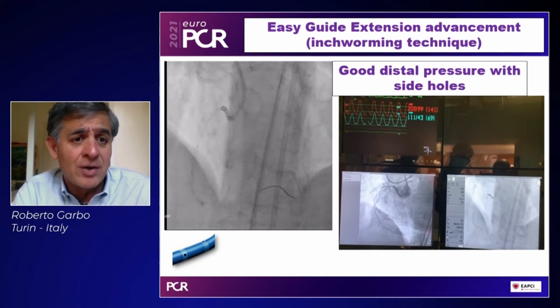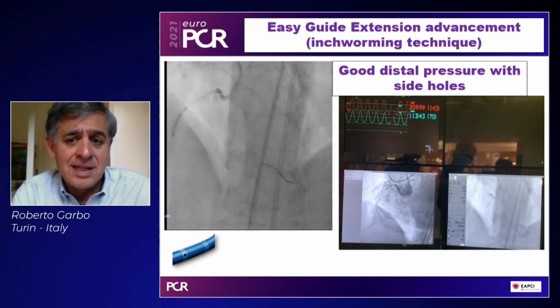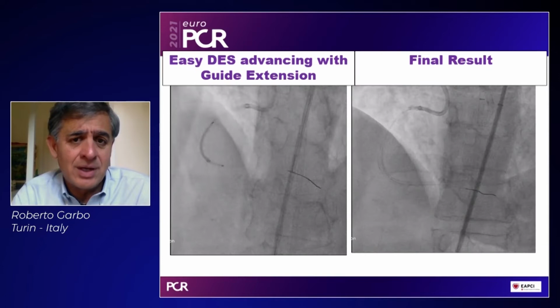And in the video on the right, you can see the pressure is maintained at more than 100. And this is important. You can see that's how it works with the side hole. You can see the pressure on the screen, even with the guide extension placed so distal in the distal right, so advancing.